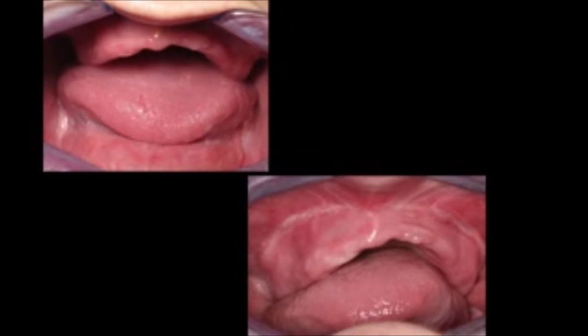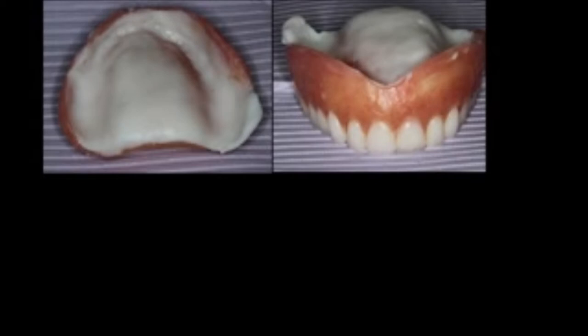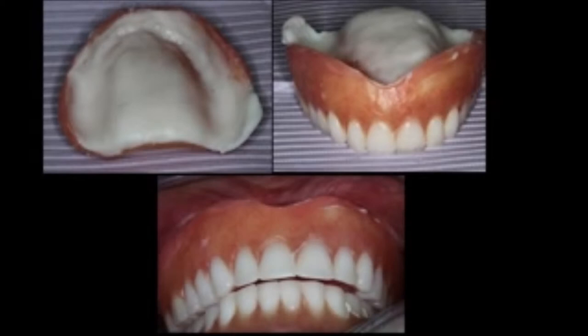Here are the original ridges, and on the right we see the maxillary ridge we just discussed. At this point it's been eight weeks since the original surgery, and a soft liner is applied — again using the co-liner — placed in, giving the patient even a little more retention.